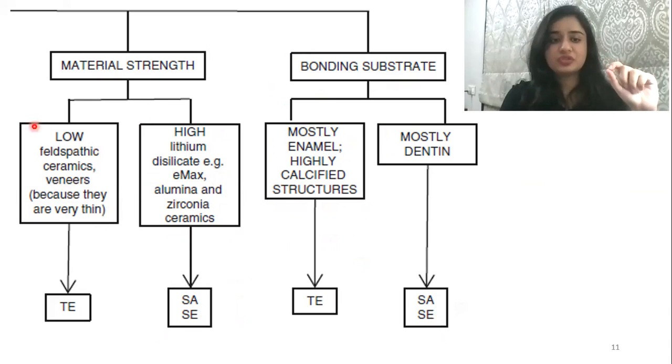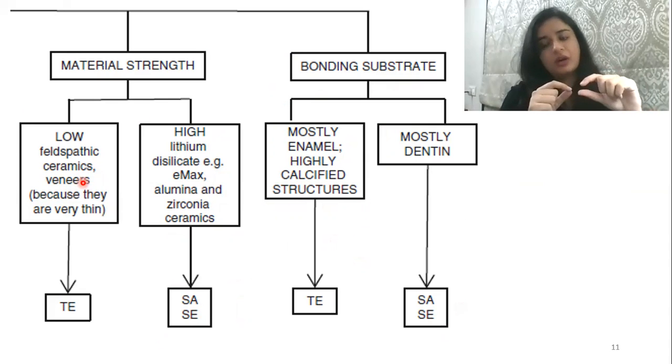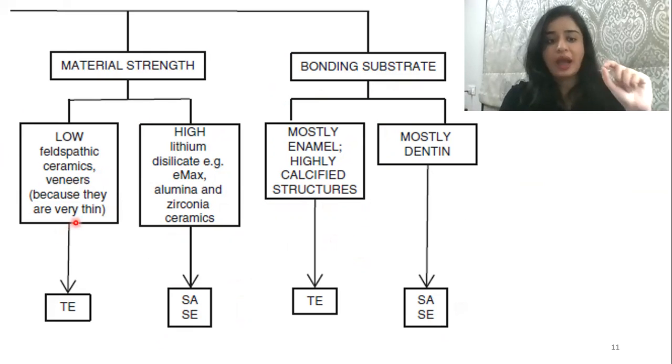Here I would like to mention that when you are going for veneers, they are very thin. So even if they are made of lithium disilicate, which has sufficient strength, you have to use a total etch system and a light cure one. That is very important.